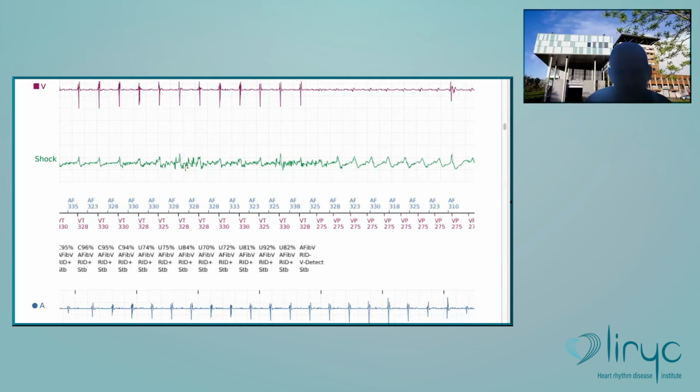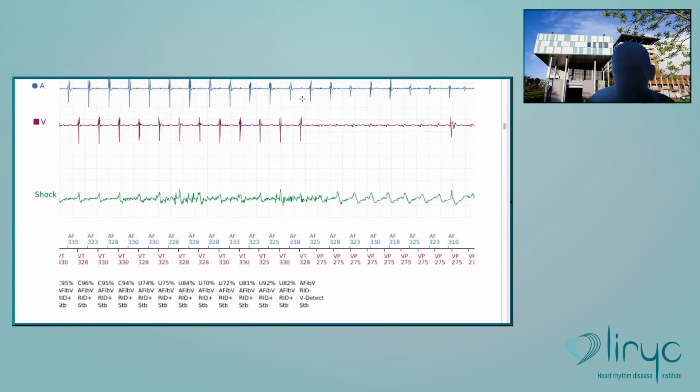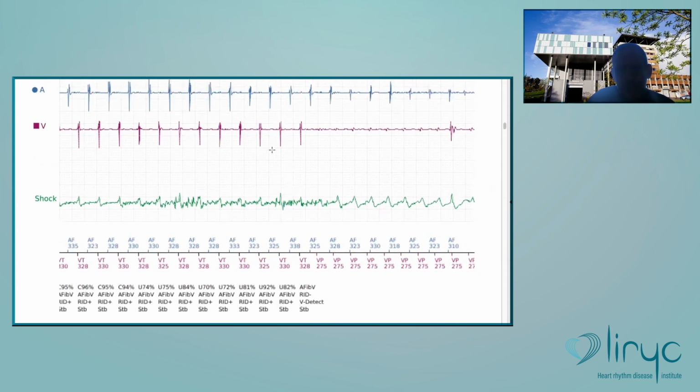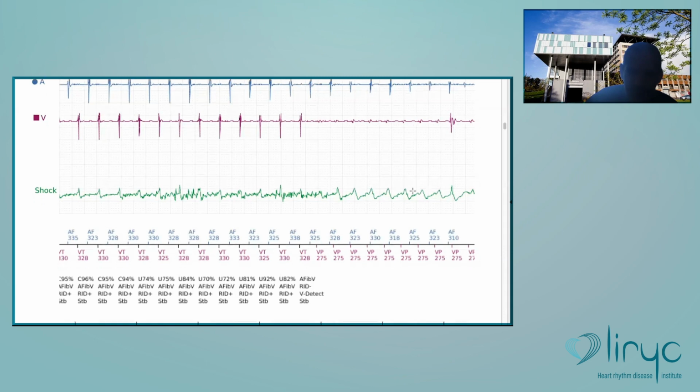So that's the time here. There is a problem with the discrimination based on the morphology, and it's a one-on-one tachycardia. The rate is very stable. So if it is stable, the patient will be treated. You understand? The device will say that's probably a VT. Since there is no correlation, that's probably a VT. So I will treat, and then the patient will receive many inappropriate therapies.